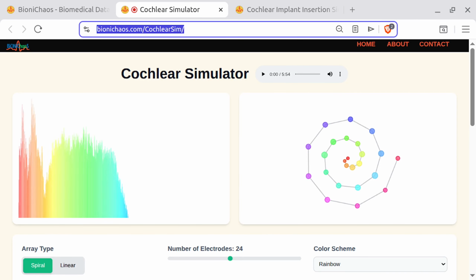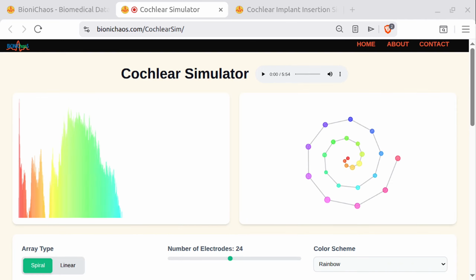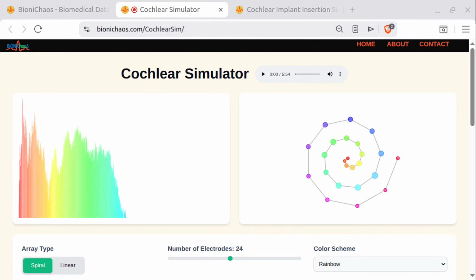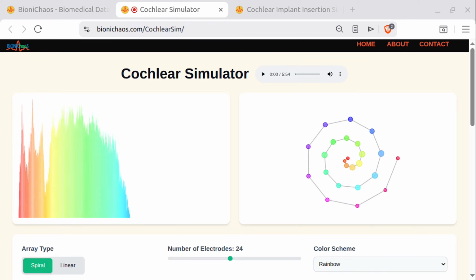And while round window insertions and flexible arrays sound incredibly elegant, you know the human body doesn't like foreign objects. The body's immune system will often attack the electrode materials, creating intracochlear fibrosis. Scar tissue, yes. That scar tissue chokes out the delicate structures inside the ear, permanently destroying whatever tiny bit of natural residual hearing the patient had before the surgery. Look, it is true that inserting a foreign body induces a foreign body response. Biology is biology. Fibrosis is an ongoing challenge, but we are actively trying to mitigate it with steroid-eluting electrodes.